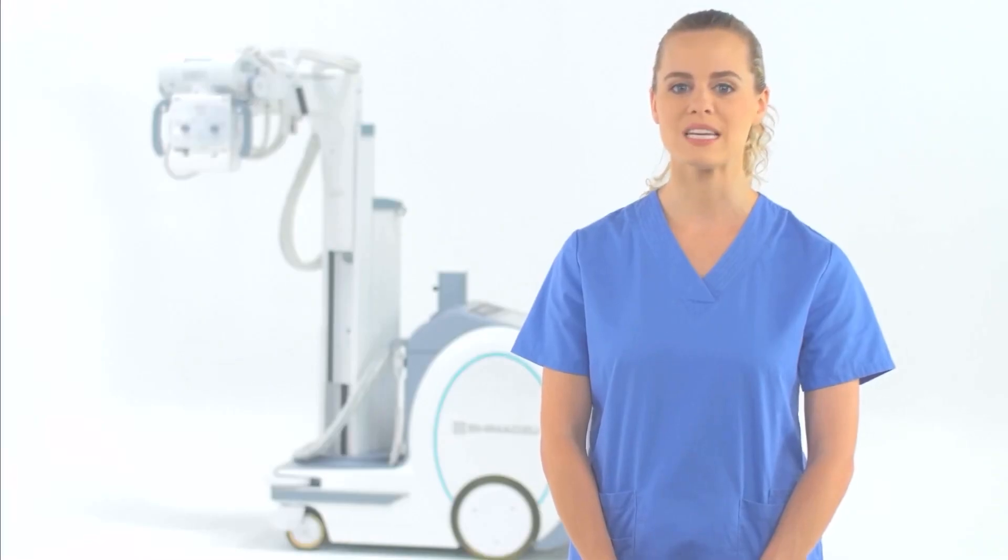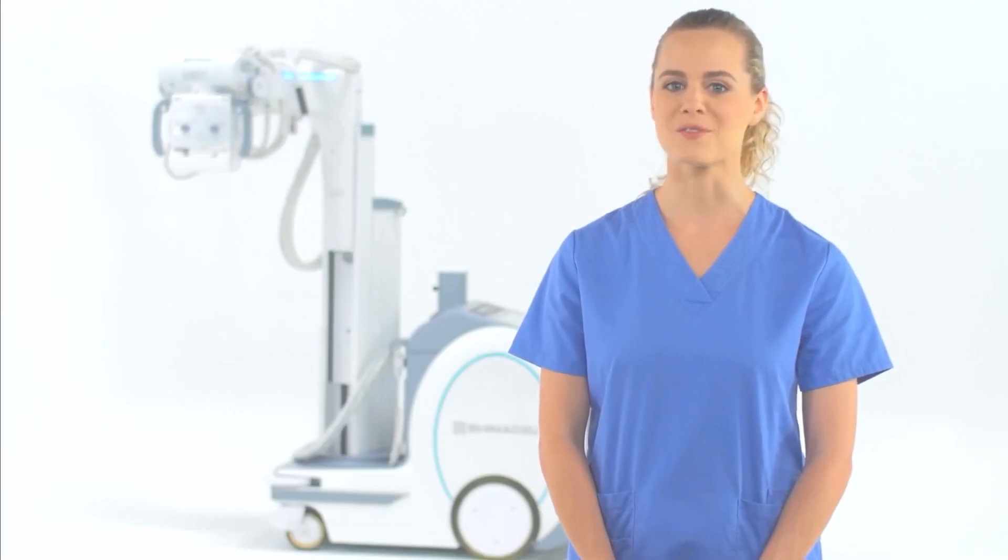This training video will illustrate fundamental operations of the mobile unit as well as patient imaging. We will cover system startup, digital acquisition setup, and of course, how to maneuver the unit to and from the patient exam area. Let's get started!